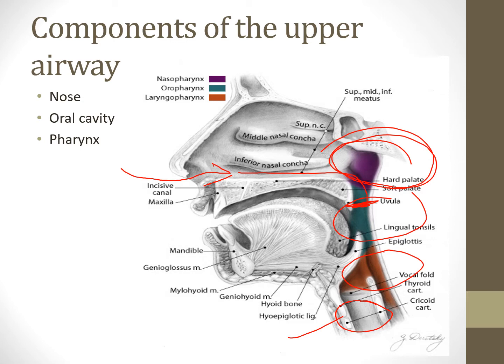So when we're looking at this, we need to make sure that we're doing what we can to get that tongue as far away from that posterior section of the oral pharynx as we can. And then we could also use mechanical means, things like CPAP, which help stent open the airway, as you know from sleep medicine, where we use CPAP as a form of stenting, right? Pushing it open. So there's different ways to do this, and that's what we're going to be looking at here: alternate ways to make sure that the pharynx and everything is communicating appropriately with each other to help maintain ventilation, which then should help maintain oxygenation as well.